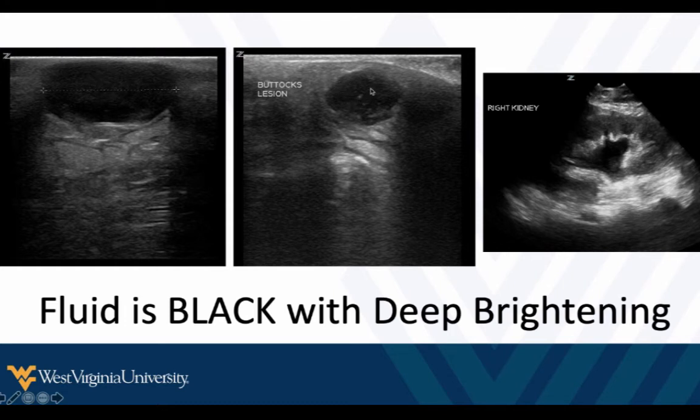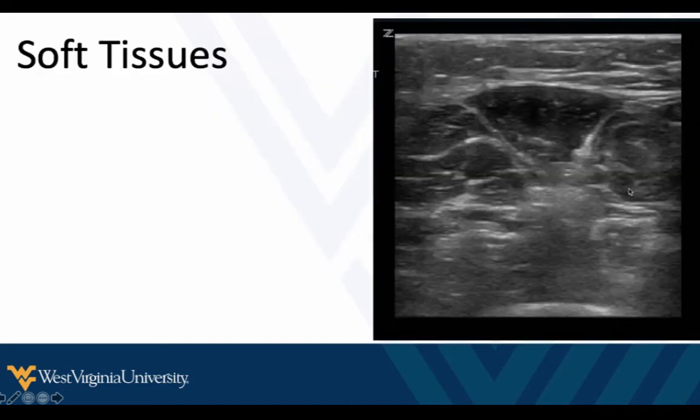Here's another abscess, with acoustic enhancement, or brightening behind. And here, maybe it's not quite as well demarcated, but we see the fluid in the collecting system, and it's a little brighter behind this. So fluid is black, with deep brightening.